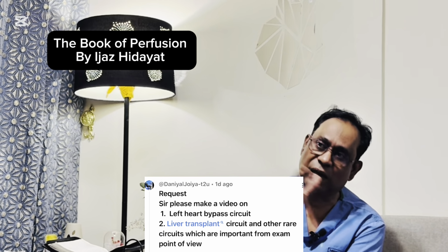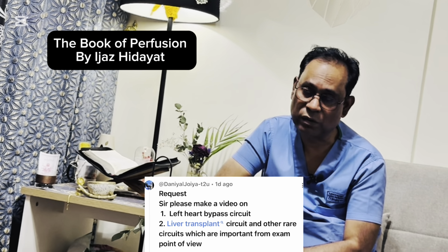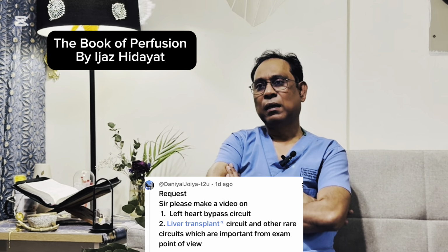Why do we need to do the left heart bypass? Sometimes if you have a patient with disease and the surgeon needs to fix the thoracic or abdominal aortic aneurysms or any abnormalities, we perform a left heart bypass to perform the surgeries.